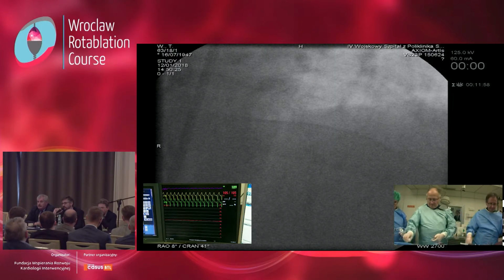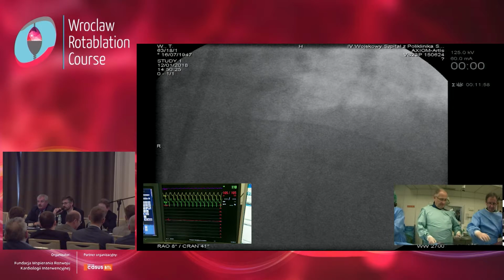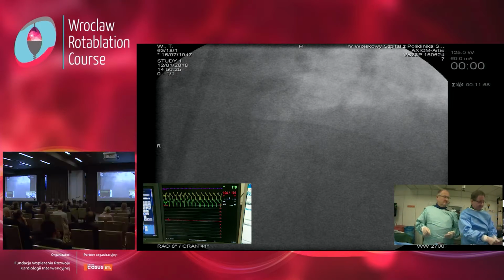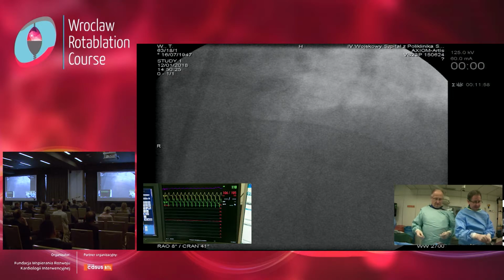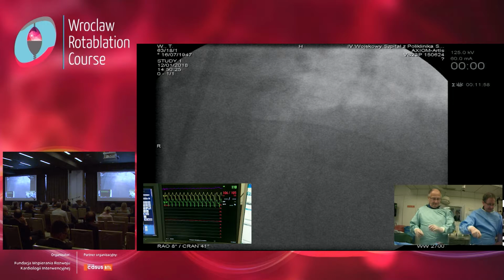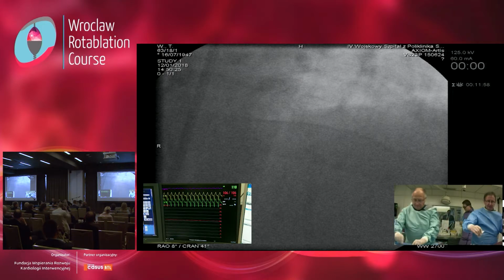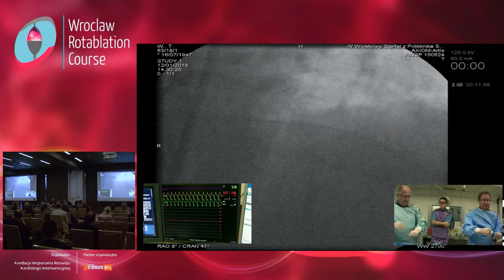Maybe you can see from there better than us, but it seems that there is a gap between the stents. Is it possible when the patient has? We will see again, but he was moving a bit during this procedure, so maybe that's why we lost its position, but we check this. That's a good point.